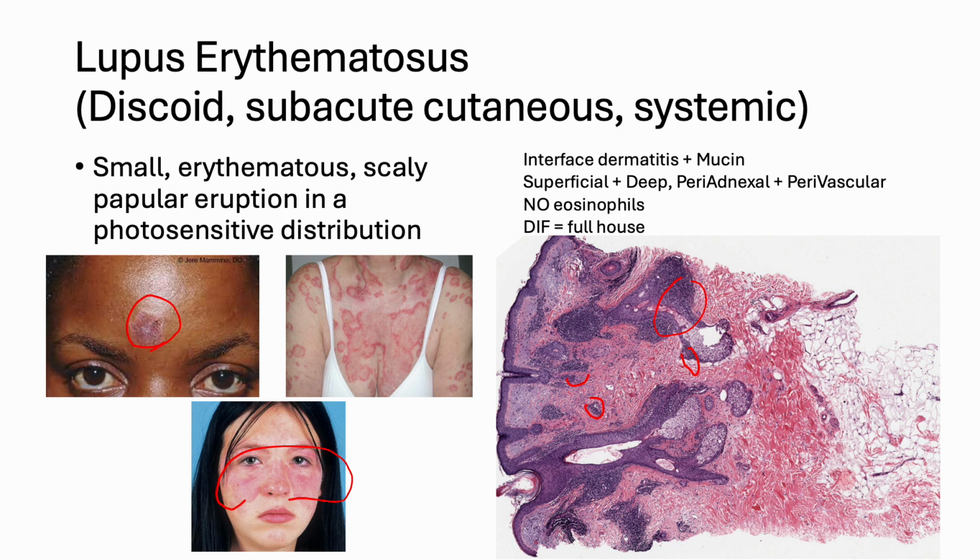So even though it's a very complex disorder, for your exam, you should be able to recognize the picture at low power. And you need to know other features, such as what the antibodies are. Probably that will be a crossover with your CP exam.